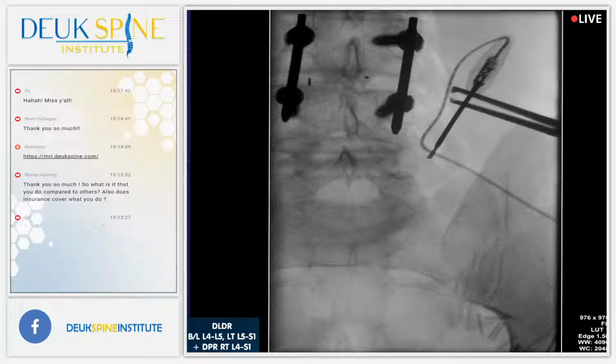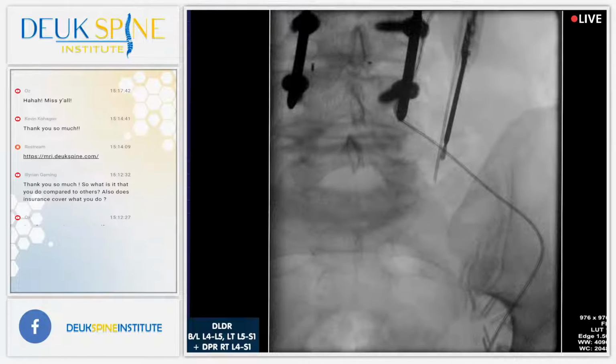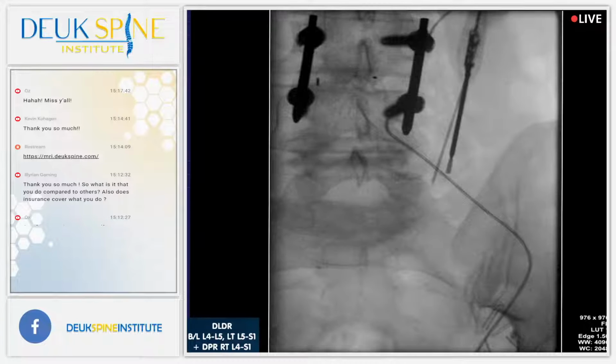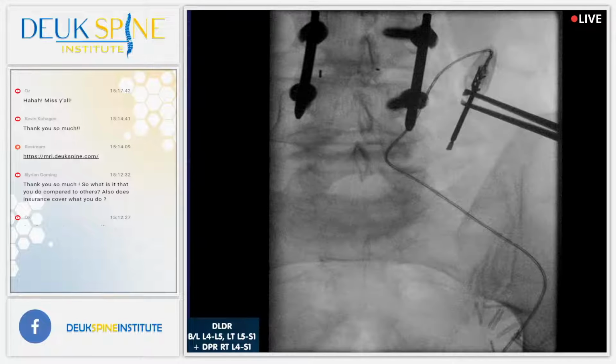All right, let me have a numb. You got it, Dr. B. For you, I'll do it. Just for you. Doing all right? Is he okay? All right. We're giving a little more numb. Just about done. About 1 or 2 more minutes.